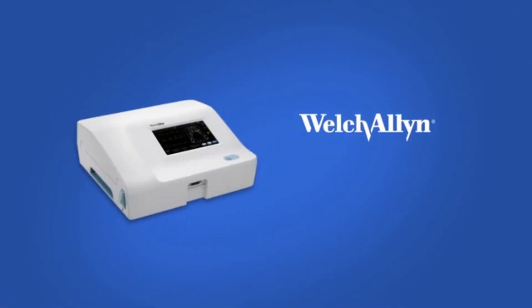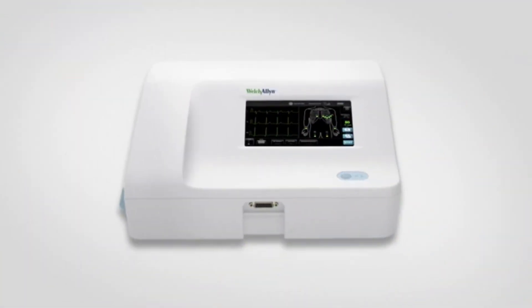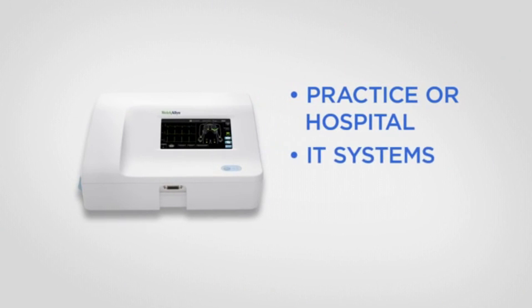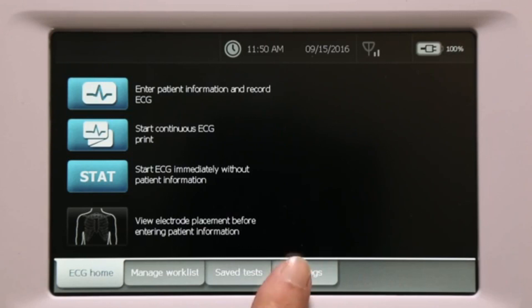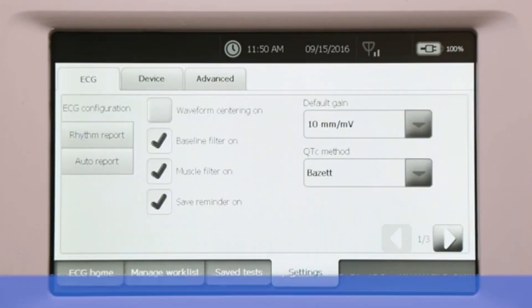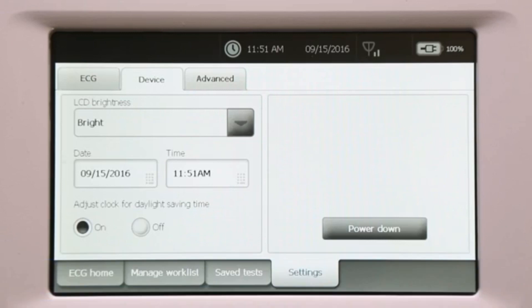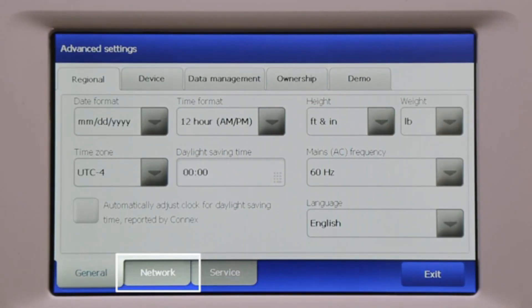Although the clinician interface is simple and intuitive by design, the CP150 is highly configurable to the needs of your practice or hospital IT systems and connectivity platforms. The Settings tab is organized in several sections: ECG for general ECG test settings, Device tab for brightness, date, and time, and a password-protected Advanced tab for connectivity settings including wireless and DICOM.